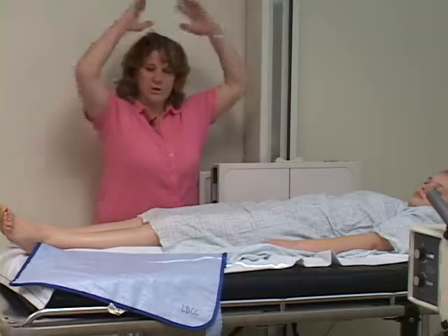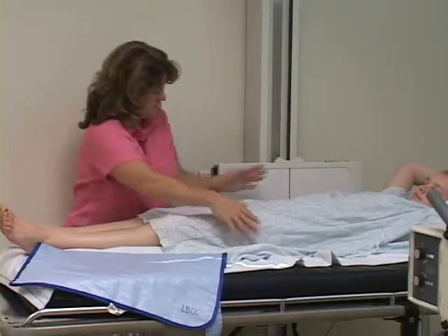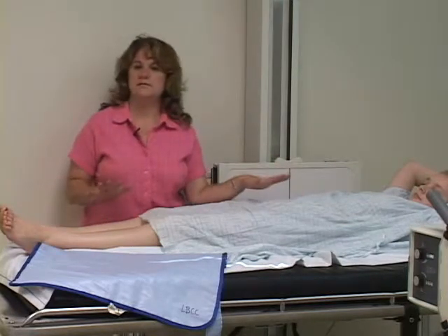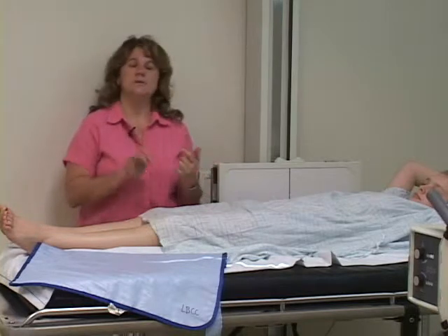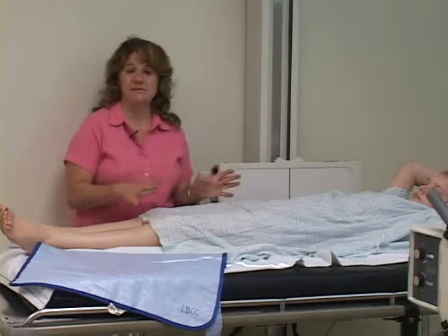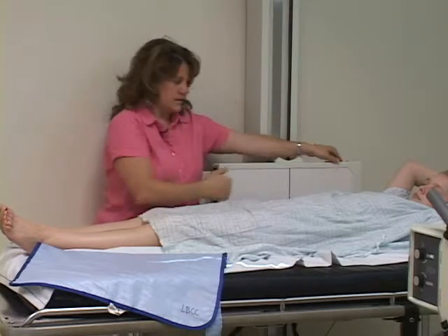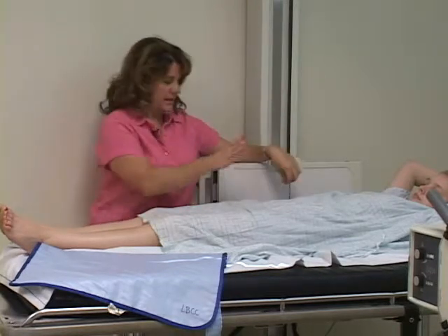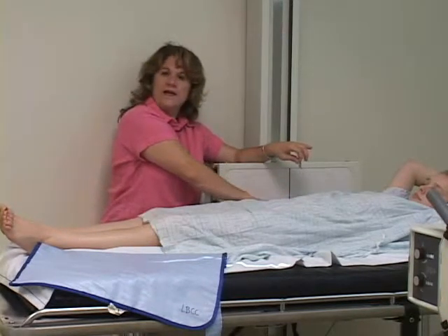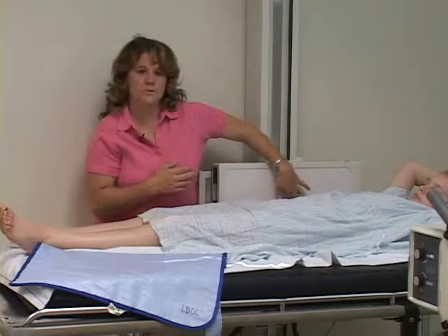Then I'm going to have the patient bring their arms up above their head. Just move them up like that. Perfect. Okay. Again, I'm 2 inches above her iliac crest. For most patients, because this is an abdomen, you're not going to do shielding because the reason that you're doing these is you're looking for aneurysm or hernias or masses. So my bucky is now lined up to my tube, both crosswise and lengthwise. I'm going to make sure that I have the correct body side marked on my IR, so her right side is closest to the bucky, so that's the side I'm going to mark. That's where I will put my marker.